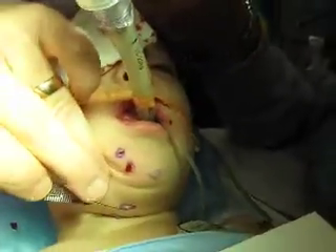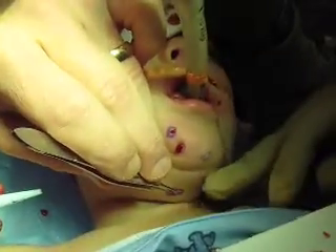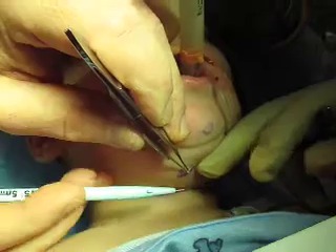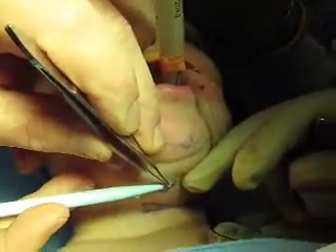Now notice these underneath, in the fold of the neck. It would be very easy to miss these if mom didn't identify them ahead of time.